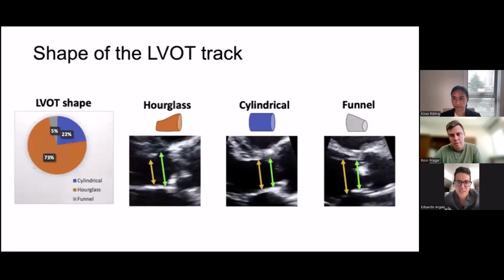And because the patient had severe sepsis, they just kept pumping on more vasopressors, and this was norepinephrine, and we all know that LVOT obstruction worsens with norepinephrine. And I'd say they were relying on a poorly acquired VTI that didn't have a good Doppler envelope velocity, but then they also ignored a significant clinical finding that was present.